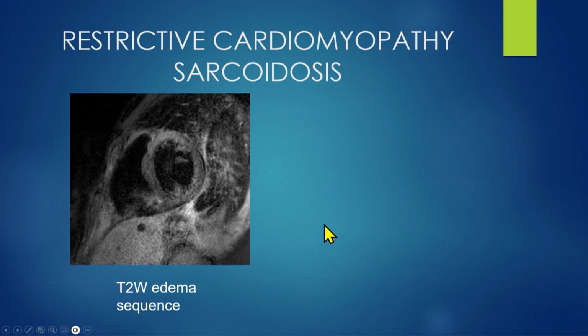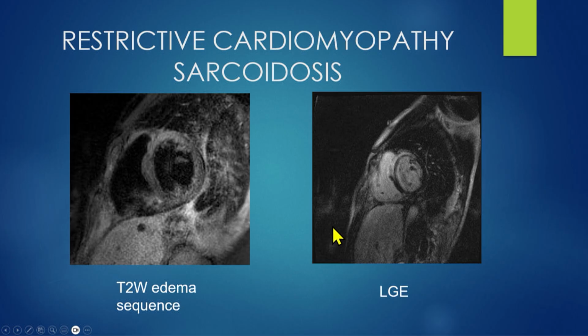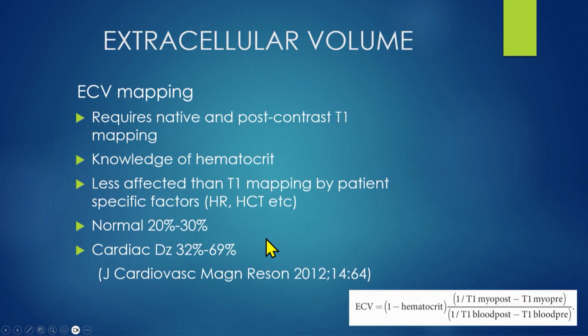And by the way, everybody talks about the adenopathy and the lung findings, but the number one cause of death in sarcoidosis is sudden death. So if there's cardiac sarcoidosis, and you can see subendocardial enhancement here, it's not ischemic, it's something else. Is it amyloid? Is it sarcoid? It's not ischemic. In this case, it was sarcoidosis.